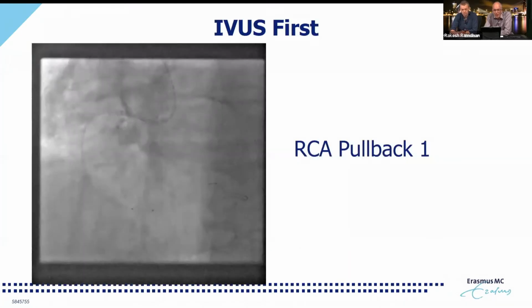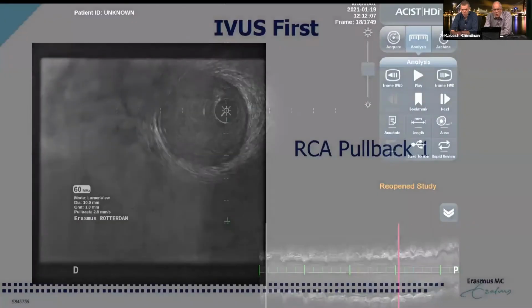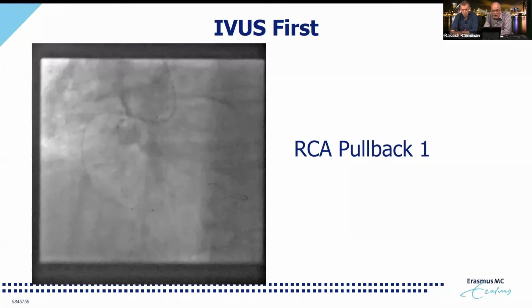If you look at the screen, can we go back to the angio screen once more? Then you can recognize below a marker that indicates the tip of the catheter, and proximal from that marker, you see the indication of the IVUS probe, which indicates where you start your IVUS. You see the two distal markers at, let's say, 6 o'clock; the one most to the left is the lens of the imaging catheter. So that's where the IVUS actually starts to look, where the crystal of the IVUS is.